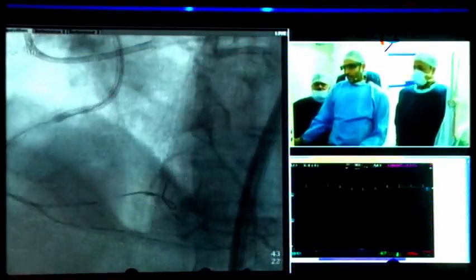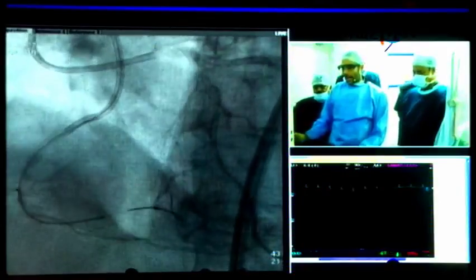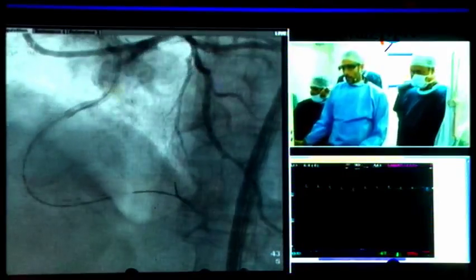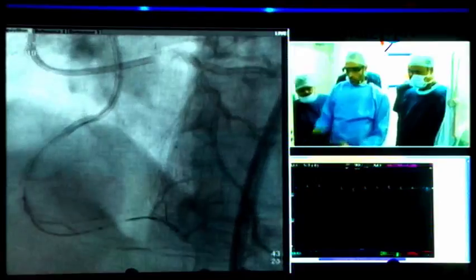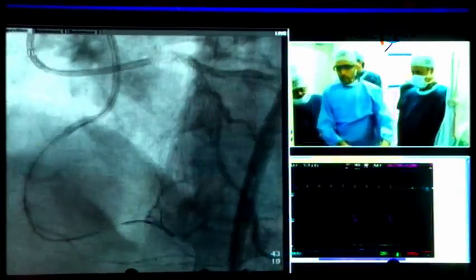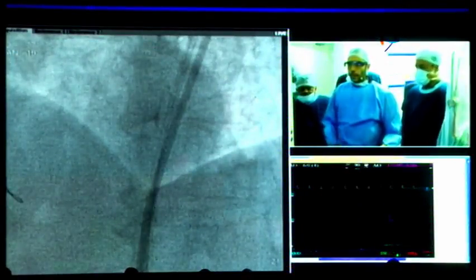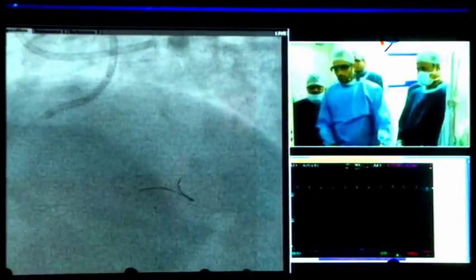I think we are intraluminal. So what I'm going to do before I do anything is to IVUS it, see where I am, and then go from there. Is there any other thing that you would do differently? It's a cyan blue. It never buckled. Do you want to play around with the tip of the wire again and try to reposition it? Nope, I'm going to IVUS it.